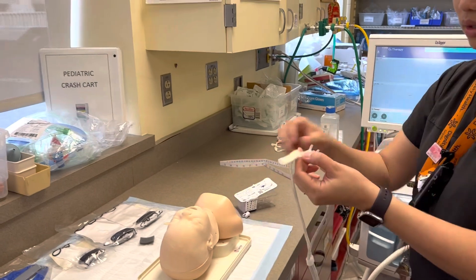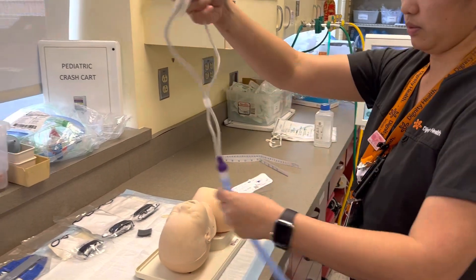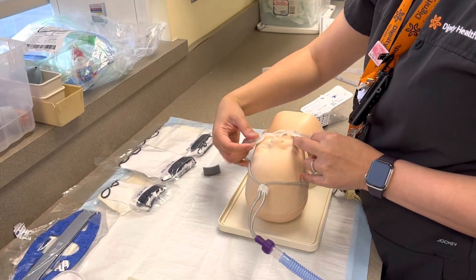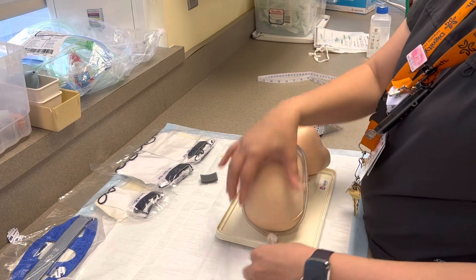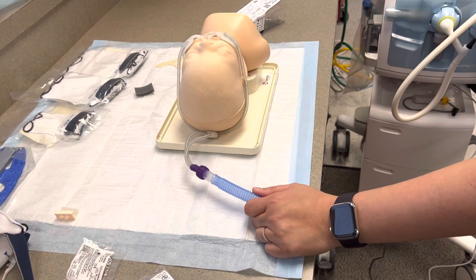Go ahead and take the protector out from the head of the baby. Connect the cannula to the baby. Wrap it around behind baby's head. All done.